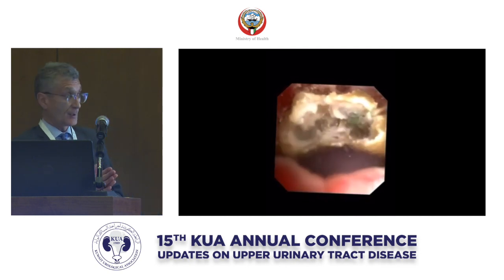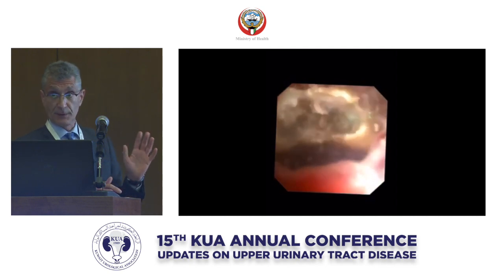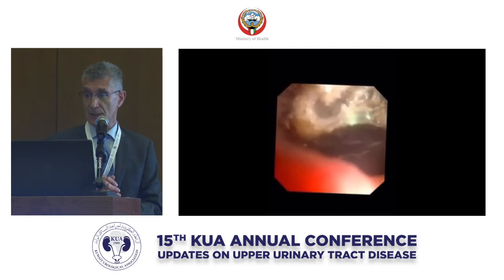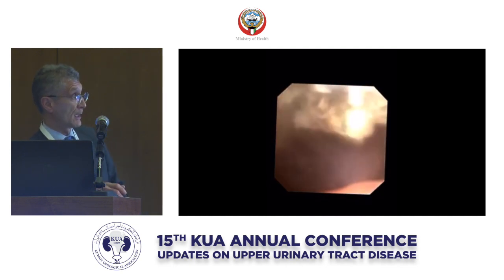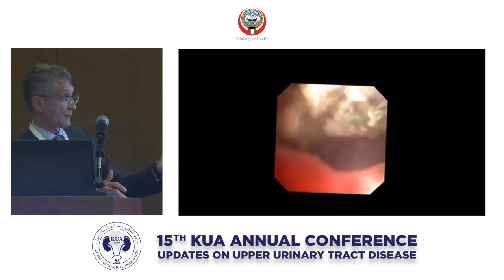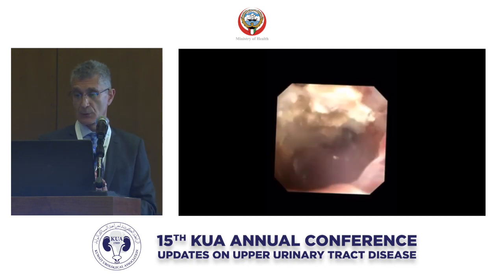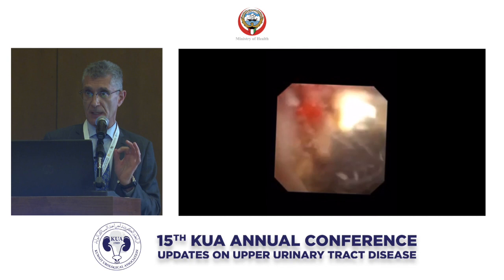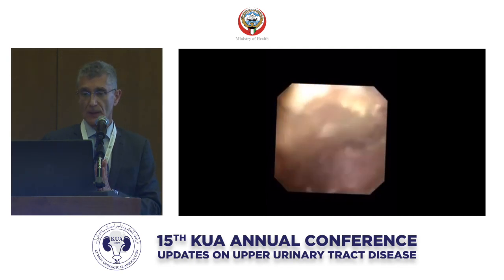A number of clinical studies have looked at outcomes, and again, as I mentioned, some of these are a little bit suspect in terms of their ultimate recommendations because of the quality of the studies. Some of them are very short in duration. Some of them have not really reported stone-free rates, all kinds of variations in terms of what frequencies and what energy settings to use. So I think the bottom line here is that it's helpful, but perhaps hasn't really made the case as strongly as what we would like to see.